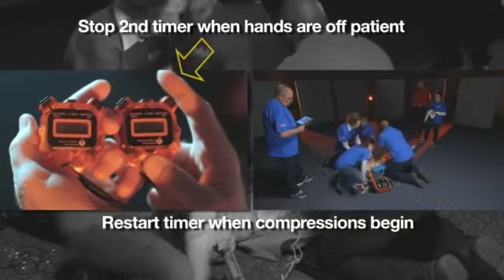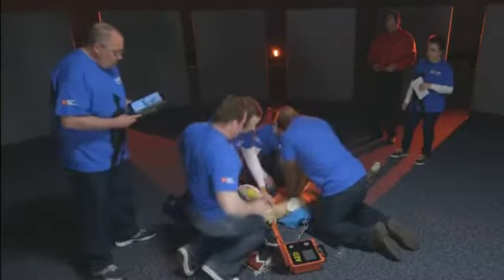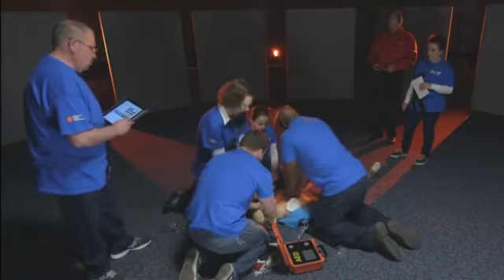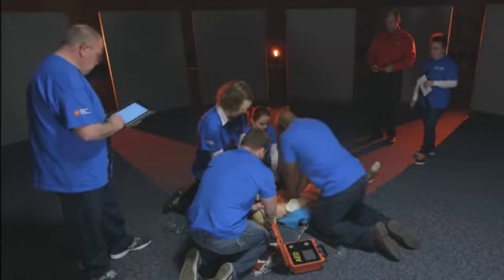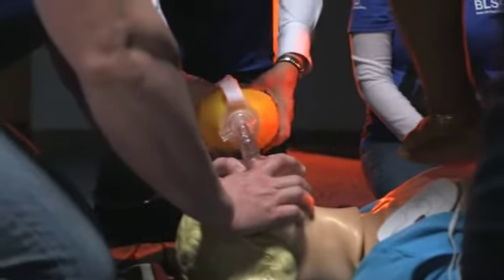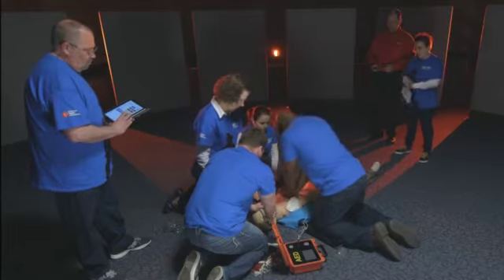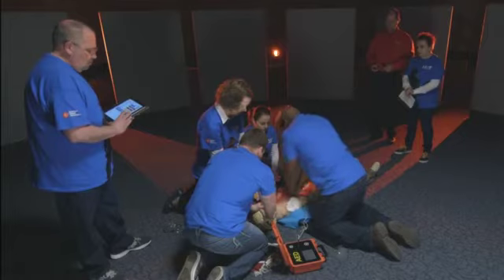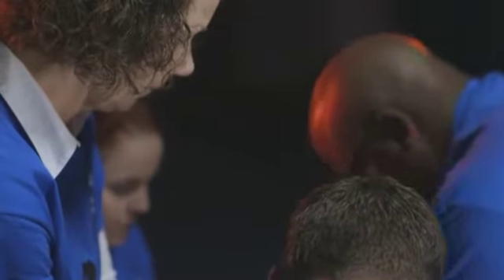Good switch. Deb checks in: Joe, are those ventilations going in okay with the switch? Joe confirms they're fine. Deb asks how the oxygen is doing — the team reports they still have enough but may need another bottle when the ALS crew arrives.